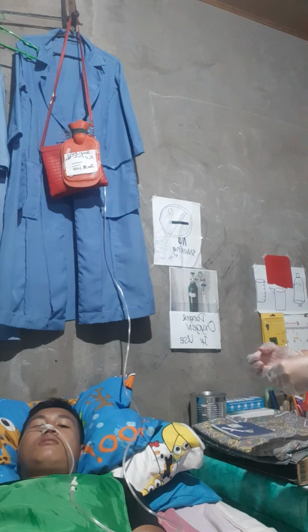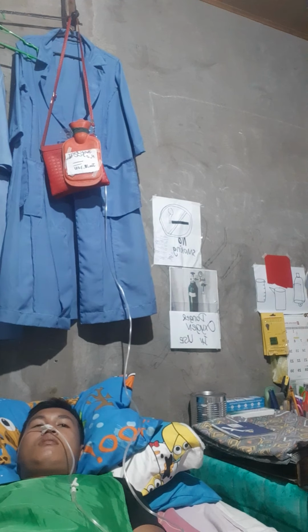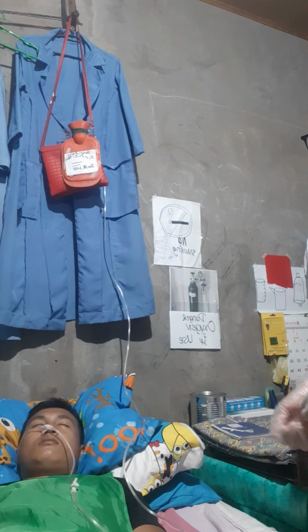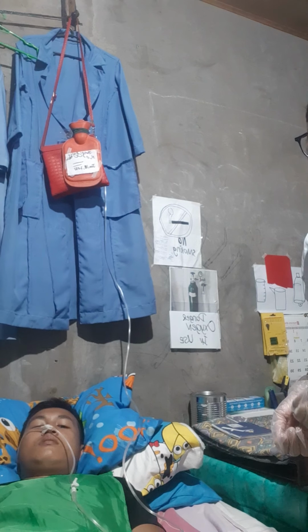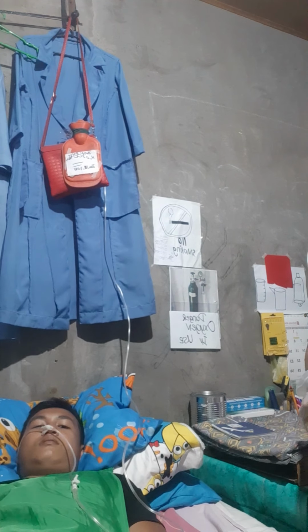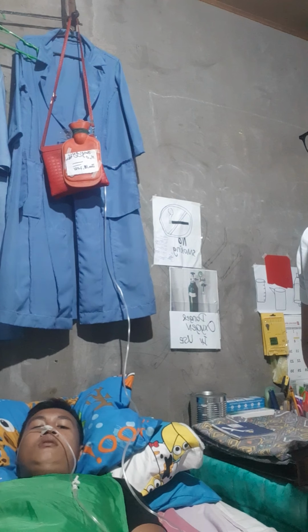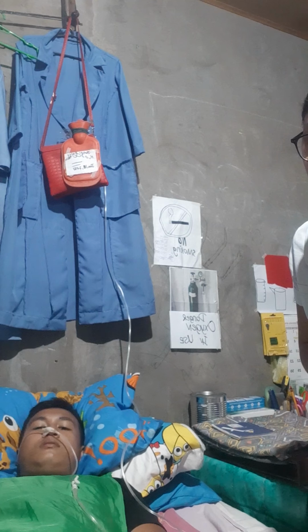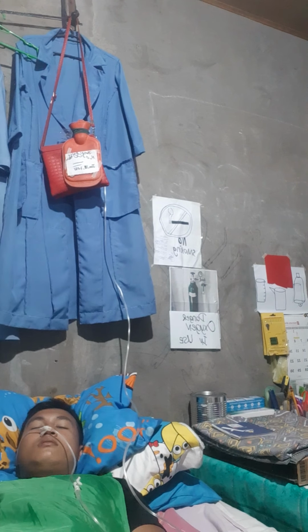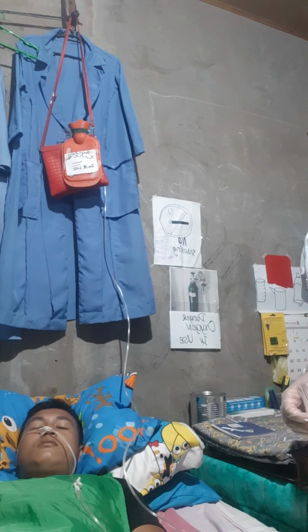And afterwards, after hanging the container on the intravenous pole, 30 centimeters, 12 inches above, we need to squeeze the chamber, one-third to half of its capacity, then open the tubing clamp.